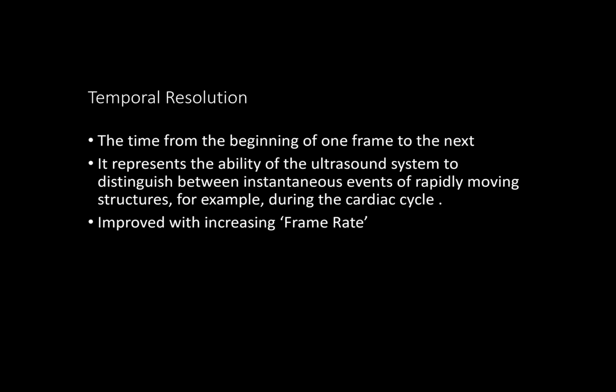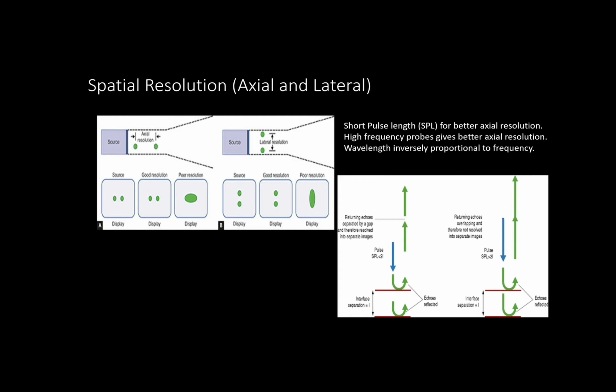So as we talked earlier, the temporal resolution is the ability of the ultrasound system to distinguish between events of rapidly moving structures, for example during a cardiac cycle. Add on the axial and lateral resolution as explained by Ramesh earlier.